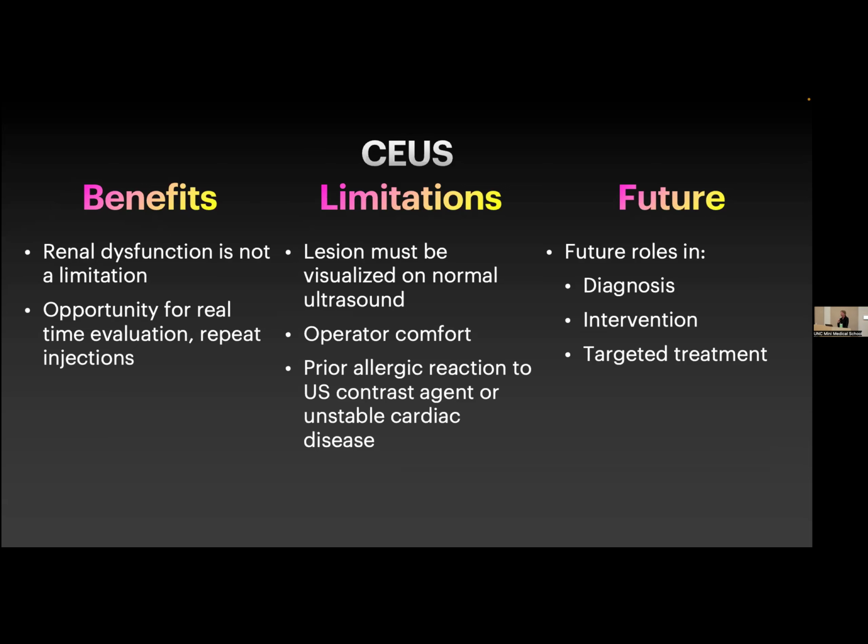Okay. So if we need to get additional pictures because we feel like we didn't catch it at the right time, unlike CT or MRI, we can just go back and take more pictures, do another injection. We have to be able to see the lesion or the mass by ultrasound. That's one of the requirements to doing this type of study.